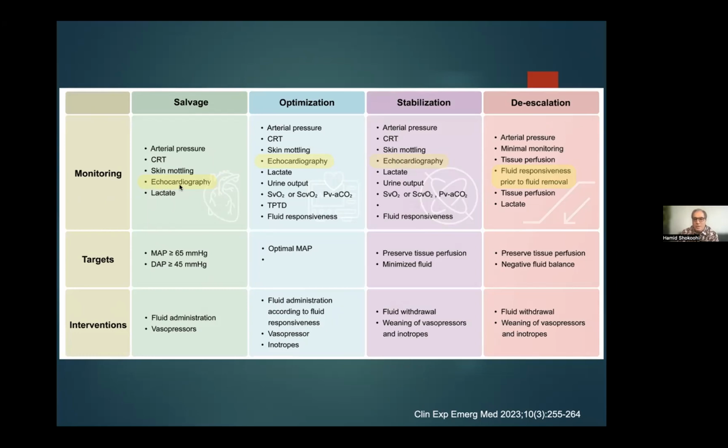In all of these, monitoring happens with echo, echo, echo. Even for the de-escalation, we need the echo to decide if we want to hold the pressor, if we want to start diuresing now from the fluid that we have given, or any other de-escalation factor that you want to do.